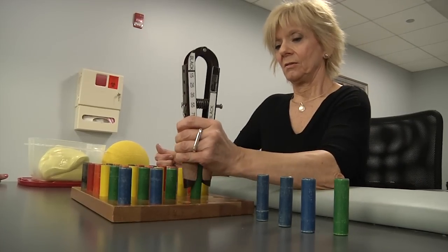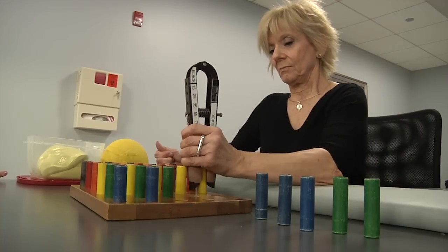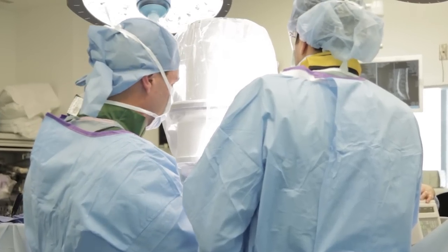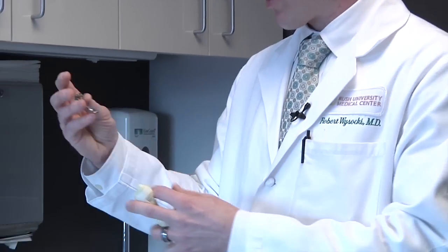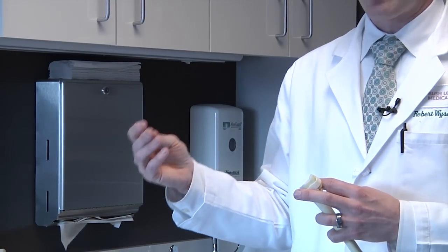All right, so what we've moved towards a lot, especially in more active or even folks a little bit on the older side like Maggie, who are still very young, is going ahead and surgically fixing them when they're displaced or out of alignment. And for a lot of these fractures is something called volar plating. It's a nice option because it's this small metal plate, as you can see here, all right? And this plate is actually engineered to be the exact shape of the distal radius.